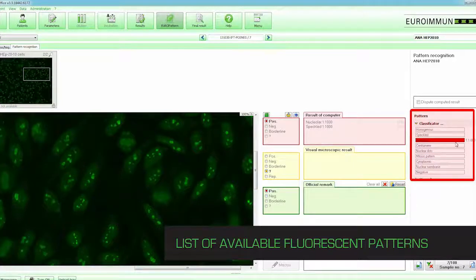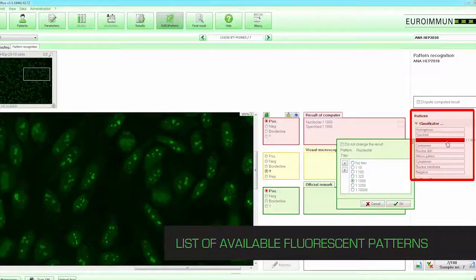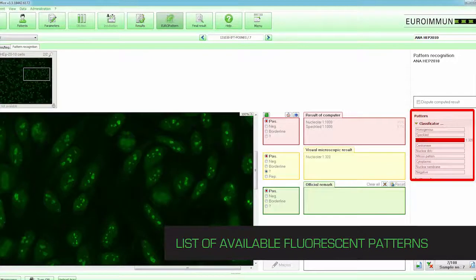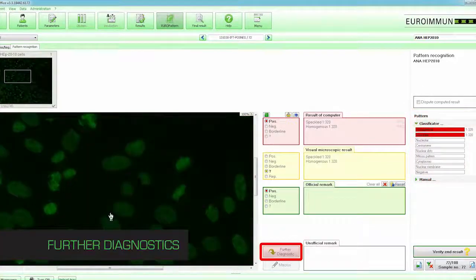An identified pattern can be included into the end result by activating the tick box next to the pattern name, after which a window opens allowing the technologist to select the required titer. Additional patterns can be added or removed by the laboratory technologist.